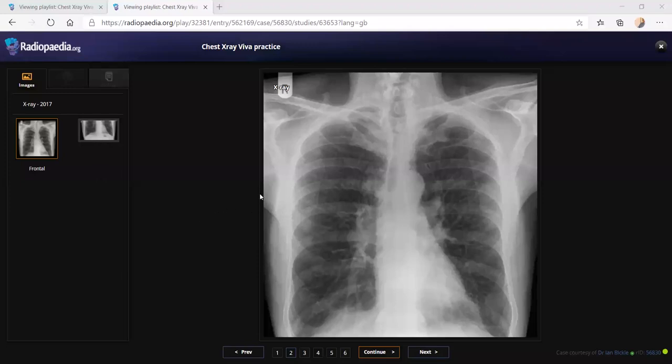Okay. So I'm thinking of a paravertebral swelling. Yeah, we'll stop here. We'll give this film to the next candidate.